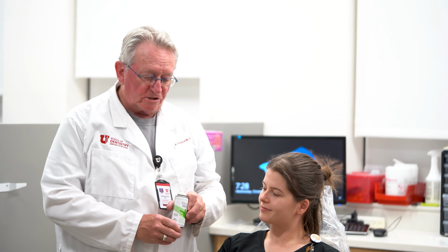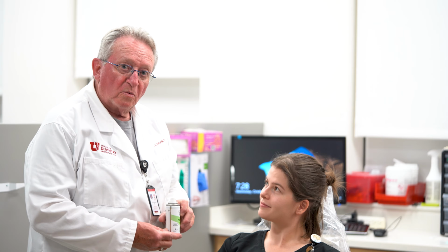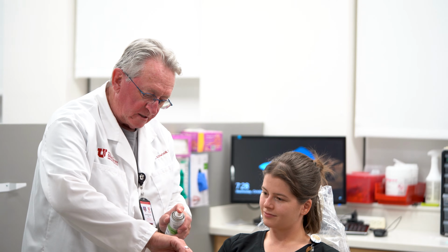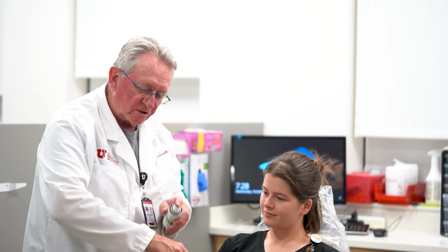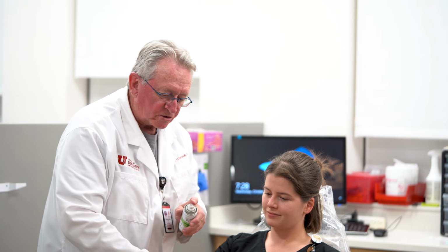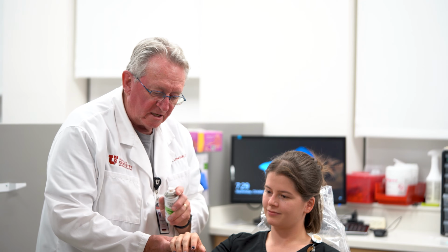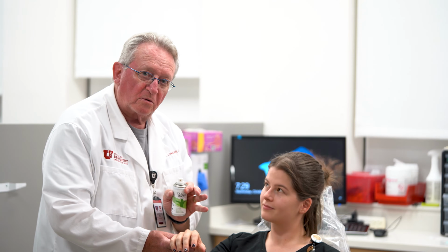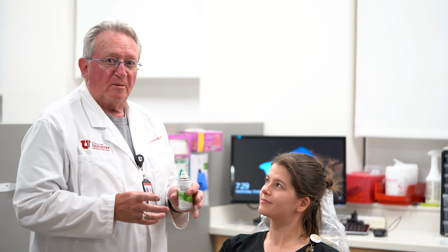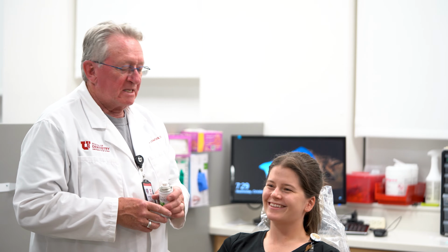So I'm going to demonstrate this. First of all, I'll show it to the patient. I'll explain briefly what it is that I'm going to do, and then I demonstrate on my hand by just spraying it onto my hand. Are you able to see that? Okay. Then I'll also spray it on the patient's hand so that they get a feel for what it's going to do, because it is quite cold, and so there's an initial wake-up shock from the coldness.